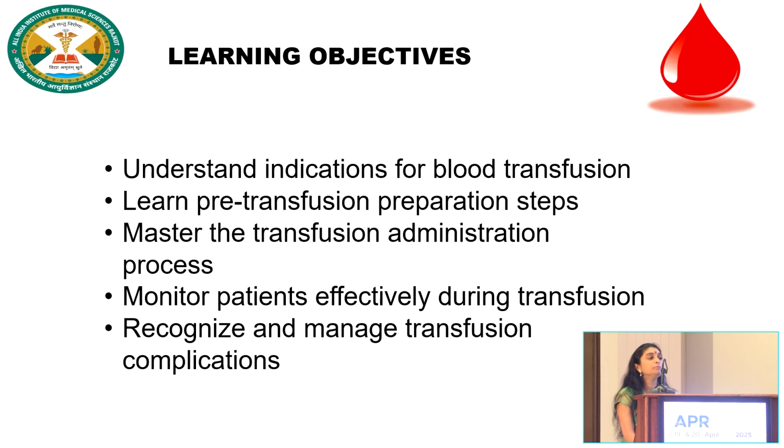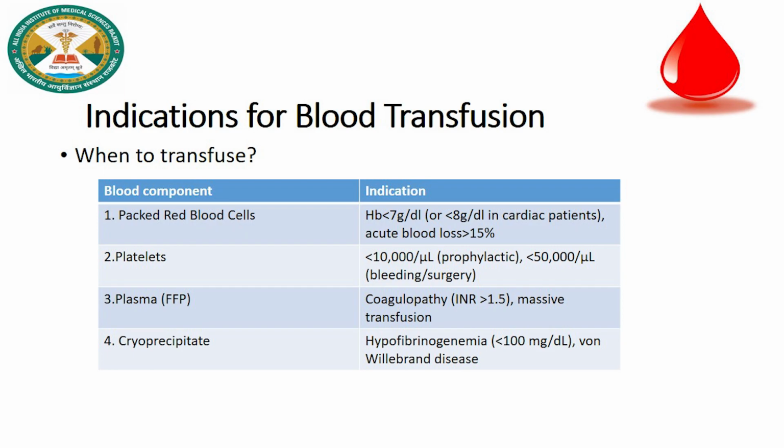So we will briefly understand today what are the indications of blood transfusion. Of course, most of us know better than me maybe. Learn pre-transfusion preparation steps, master the transfusion administration process, monitor patients effectively during transfusion, and recognize and manage transfusion complications immediately.